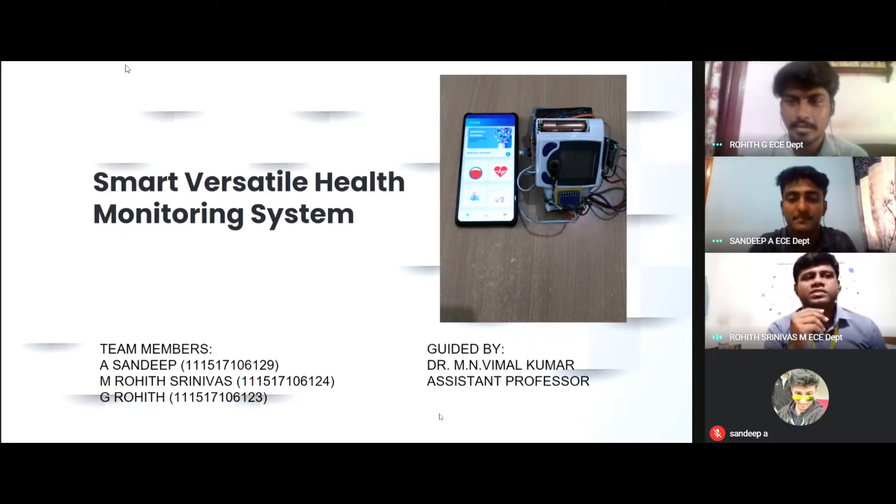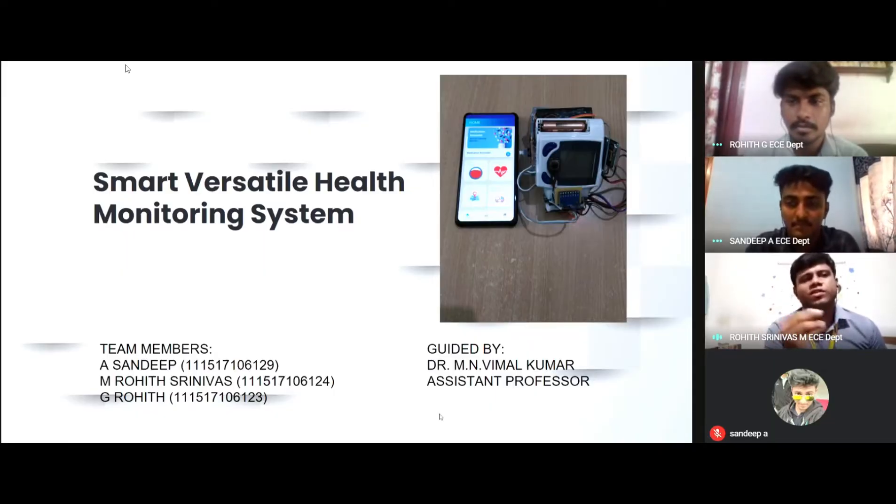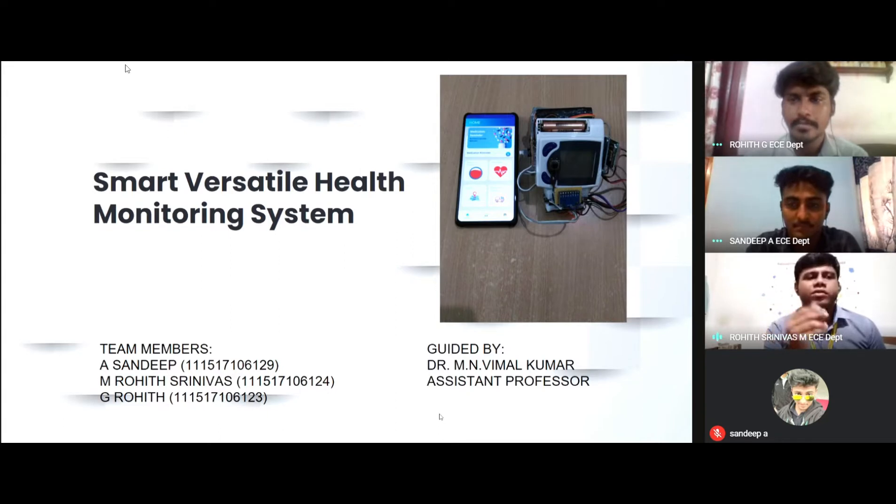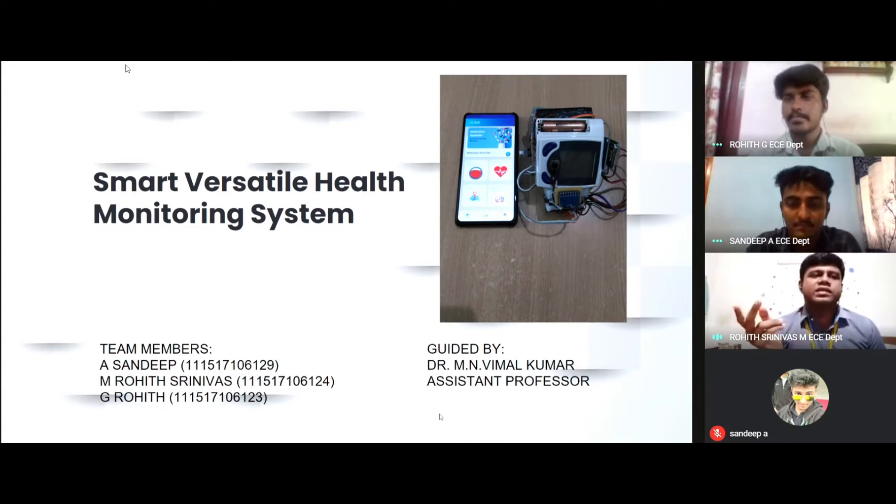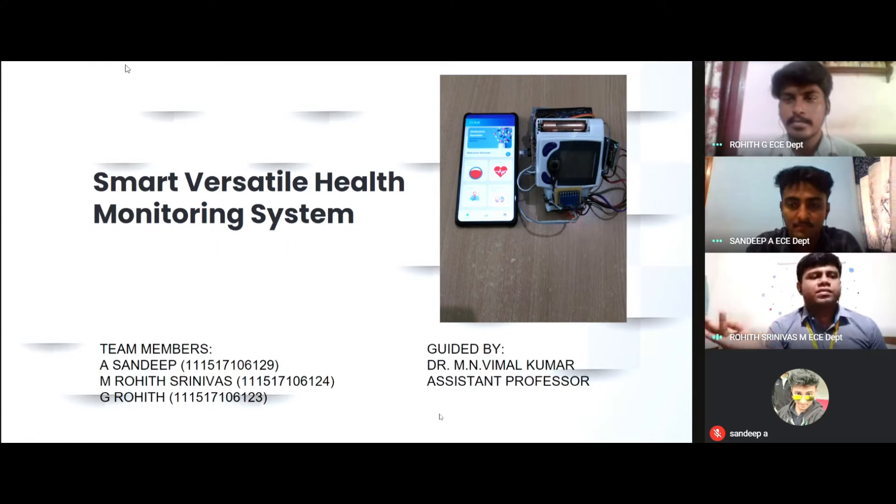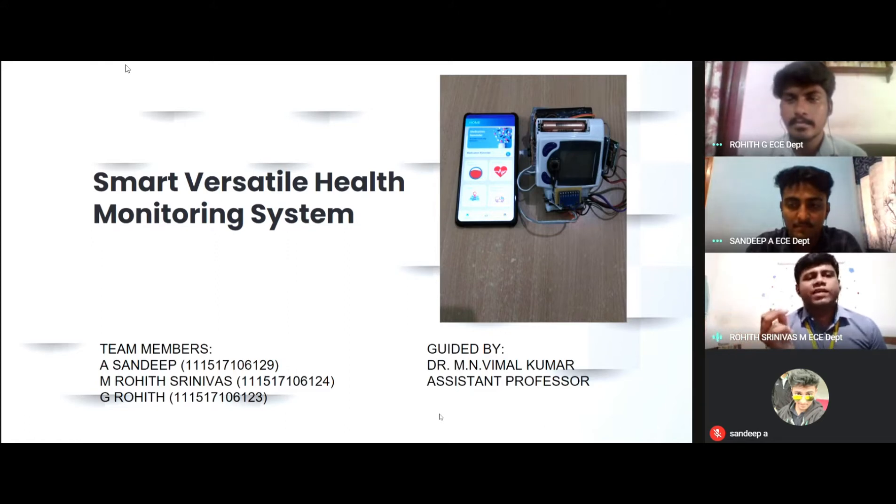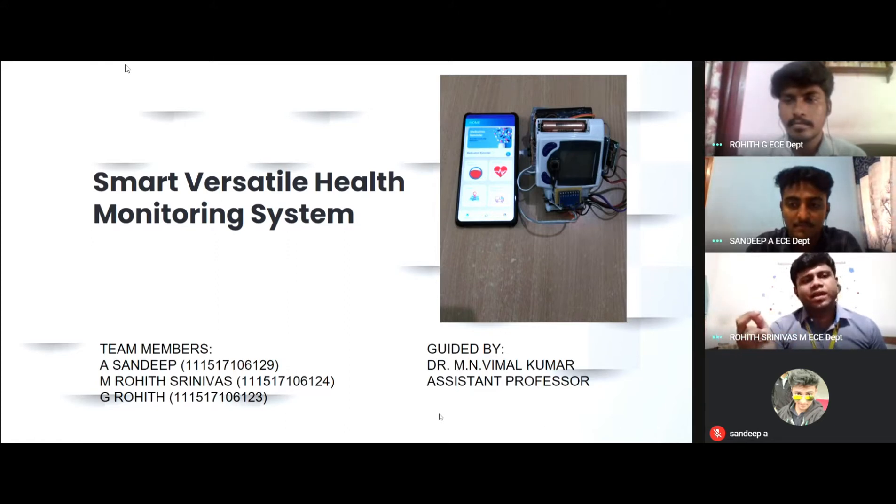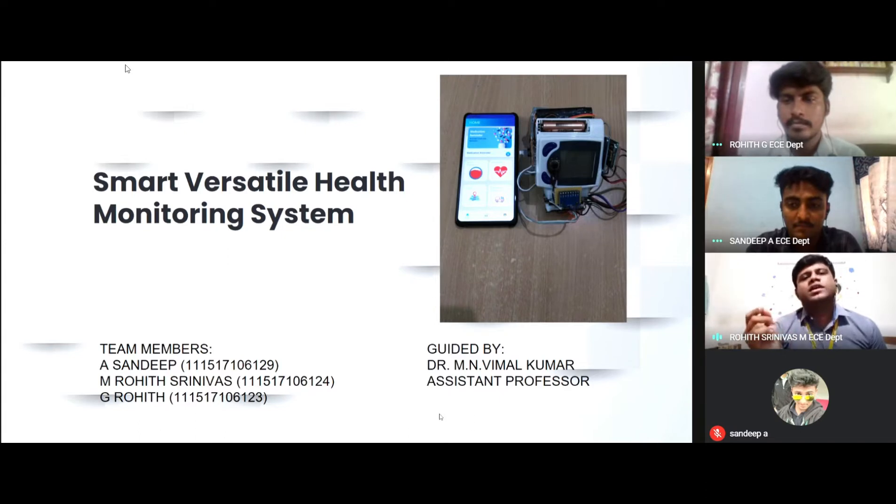As you can see our Smart Versatile Health Monitoring System, this project comprises of multiple sensors integrated to the NodeMCU such as BP heart rate sensor, accelerometer sensor and GPS sensor. These are powered by a 5V 1A rechargeable battery and it consists of a micro USB charging circuit.